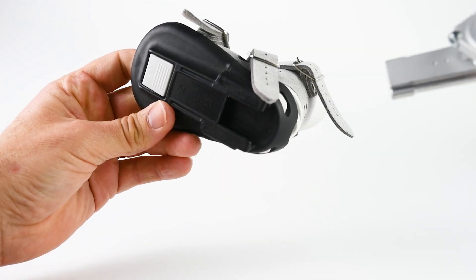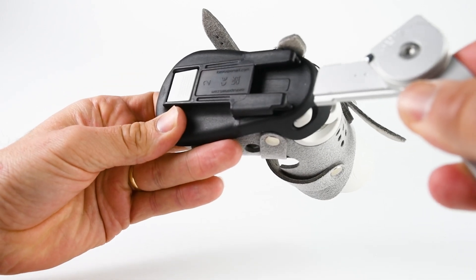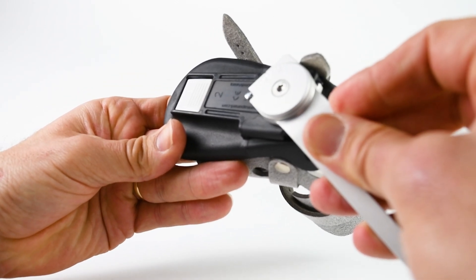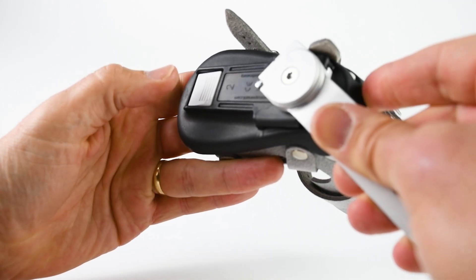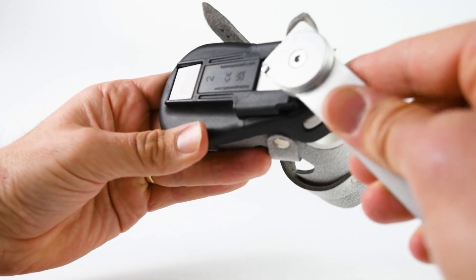To attach the boots to the bar, there's a new mechanism at the bottom. Slide the bar in, you'll hear a click, and the button moves. To release it, you just push the button in and pull the bar out.